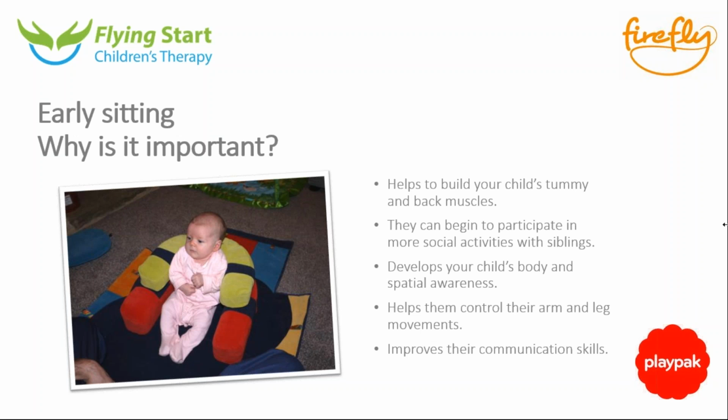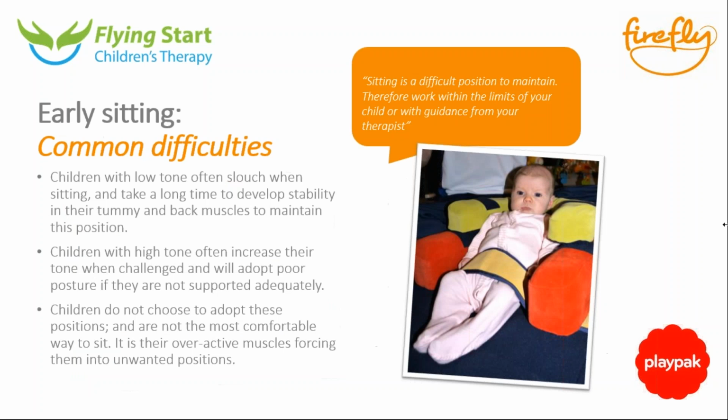It can develop the child's body and spatial awareness, because they're not just laid facing the world above them, it's to their sides as well. It can help them control their arm and leg movements independently of each other, because they can easily reach down towards their knees, similar to how we showed in the previous webinar where we were helping children reach their knees and their feet with their hands laid on their back. It's the same sort of position, but more against gravity, so gravity actually helps them reach down towards their knees and their feet. It also improves communication, because they can look at family and look around. So moving on to the next slide, Claire.